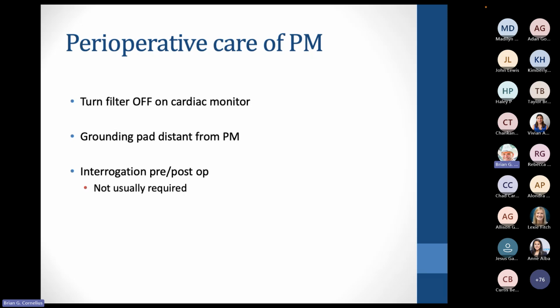They may not. Historically, we had them come evaluate it before the procedure and after the procedure just to make sure it hadn't been artificially influenced by the electric cautery or anything else that happened. We're starting to see less and less of that, and more remote check-ins, as opposed to having somebody actually come look at the patient. They may just do a phone check-in. They may be able to Bluetooth to the device, things like that, that allow them to figure out what's going on without physically being there.